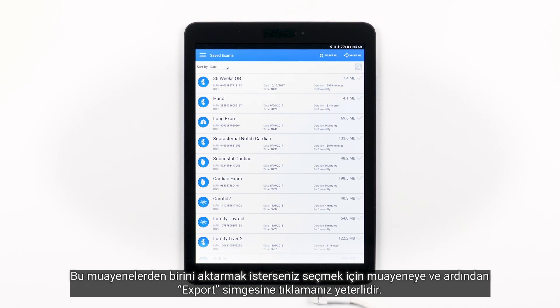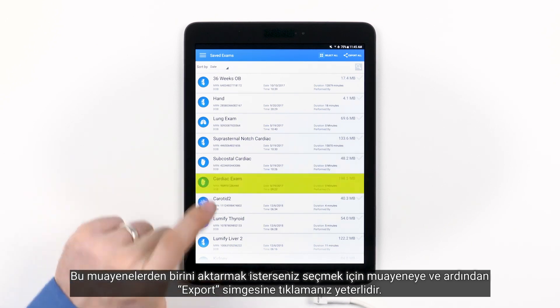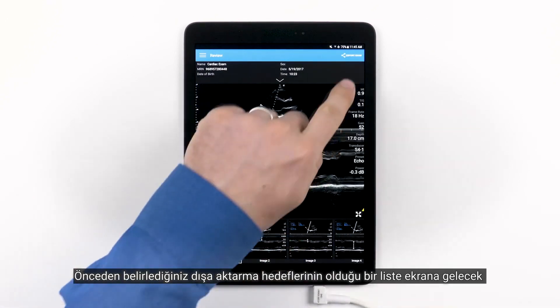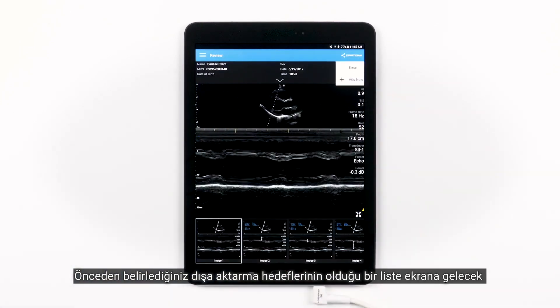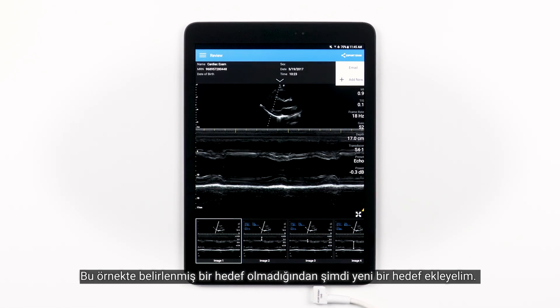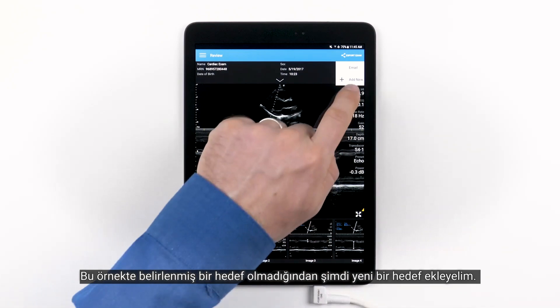If you just want to export one of these exams, you can simply tap an exam to select it and then tap the Export icon. A menu will pop up with a list of export destinations you've already set up, or it'll give you the option to add a new export destination. In this case, nothing is set up, so let's add a new destination.